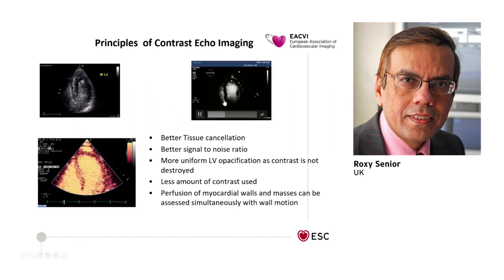You may use LVO setting, which all of you know is an intermediate MI setting, but here also, you see that you destroy a little bit of contrast, you see the LVO opacification, but you don't see perfusion at all, and you end up injecting a bit more contrast to see the LVO opacification a bit better because the contrast is getting destroyed.